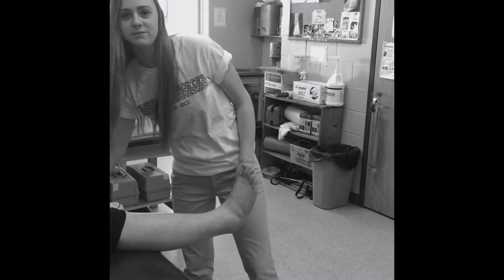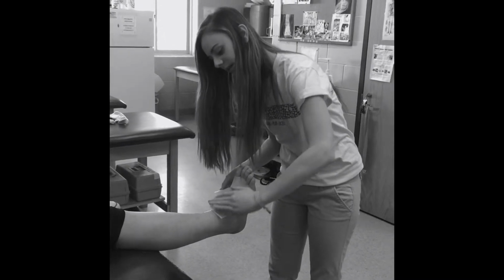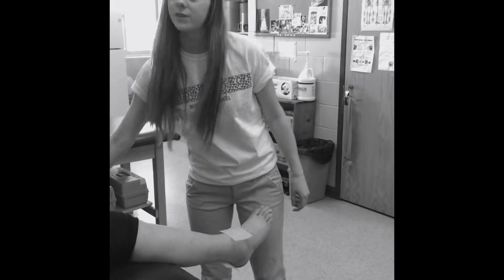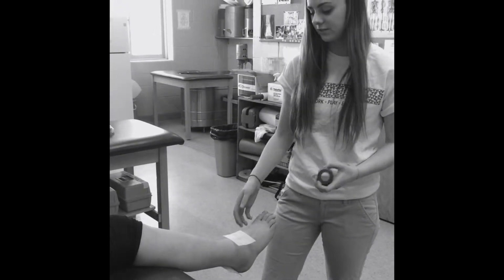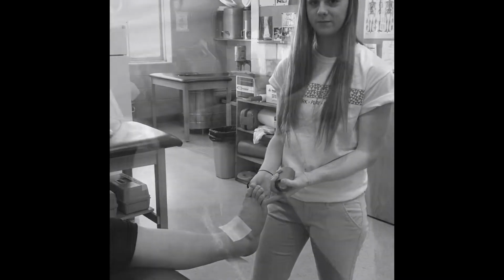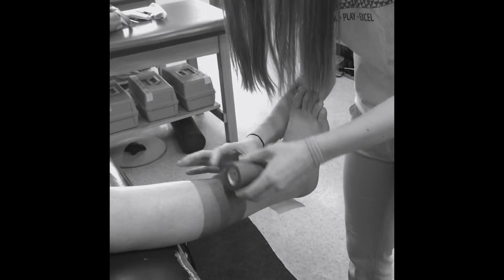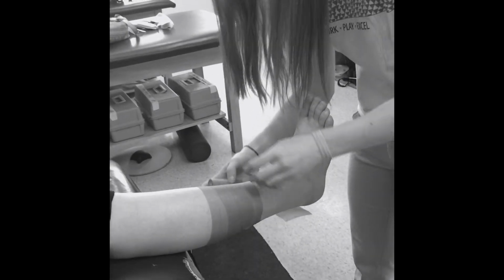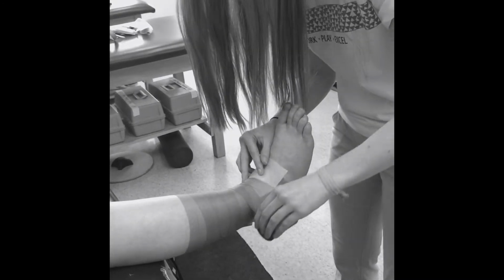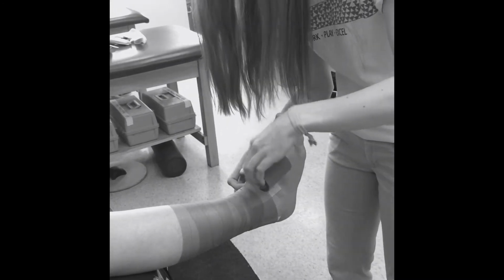After spraying the adhesive spray, you take your heel and lace pad and place one where the laces go and one on the heel. Before you begin with the pre-wrap, you want to make sure that the athlete's foot is in dorsiflexion or toes up. To start your tape job, begin applying the pre-wrap where the calf muscle begins. Carefully wrap the pre-wrap around the heel and lace pads to lock them in place.